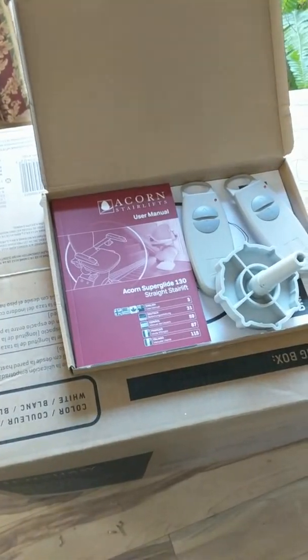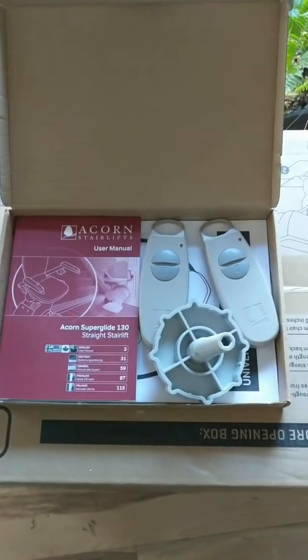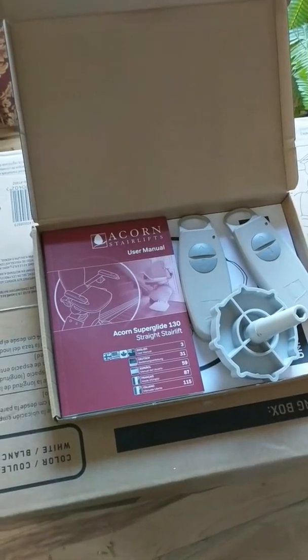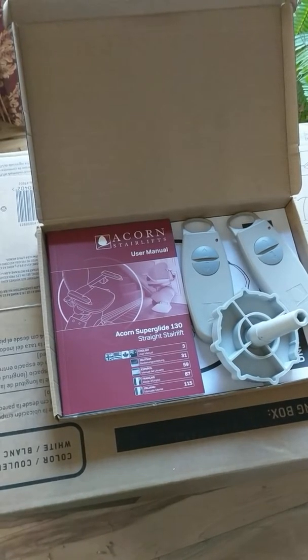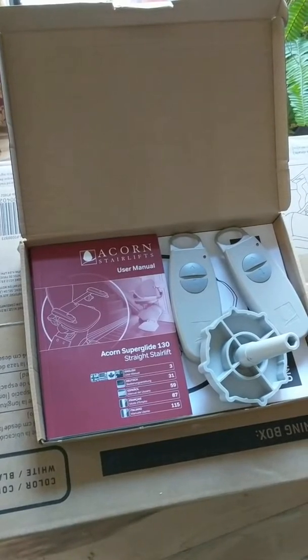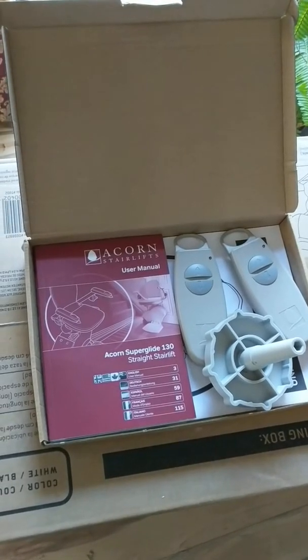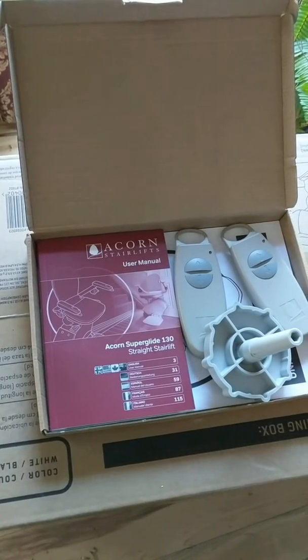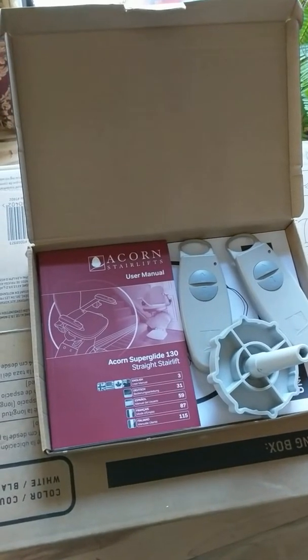Hi everybody, I wanted to do a little demo. I'm having some renovations done on my house, excuse all the mess. I had a Focus Acorn Superglide 130 installed for my mom, who is going to be moving in with me. The maximum weight is 350 pounds, which is more than enough for what we're needing.